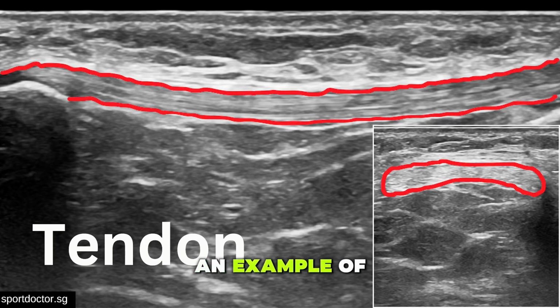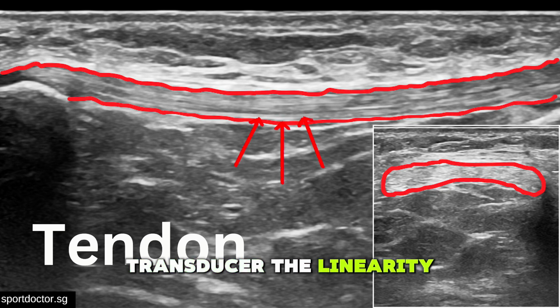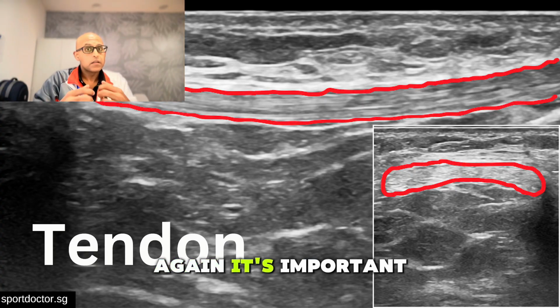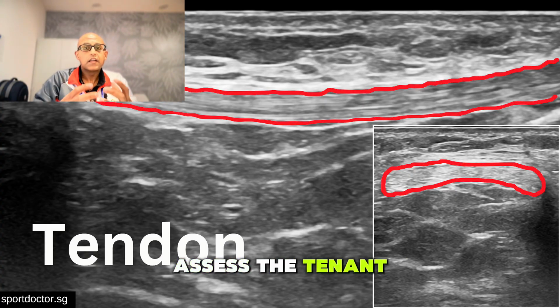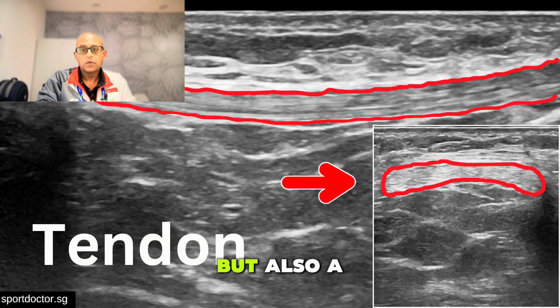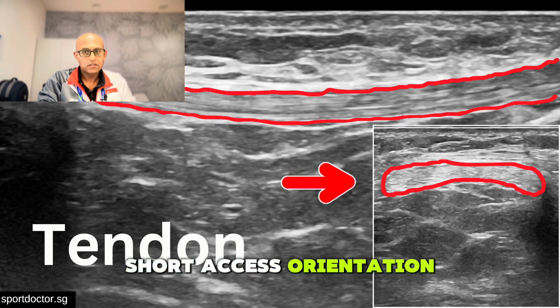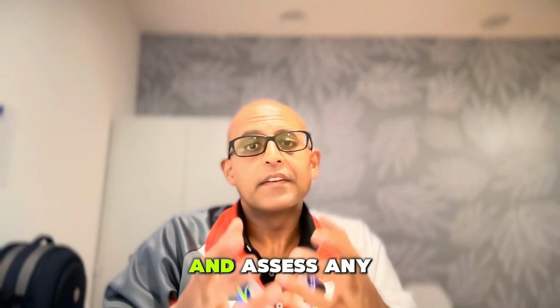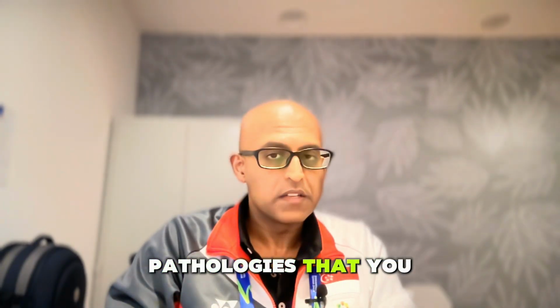Here we have an example of a patella tendon. Again, we can see with a linear transducer the linearity of the tendon. We can see the fibrils. Beneath it, we can see the fat pad, and we can see that the tendon attaches from the patella down to the tibia here as well. Again, it's important not only to assess the tendon in a long axis orientation, but also a short axis orientation as well. In both orientations, you must measure the thickness and assess any pathologies that you may see.